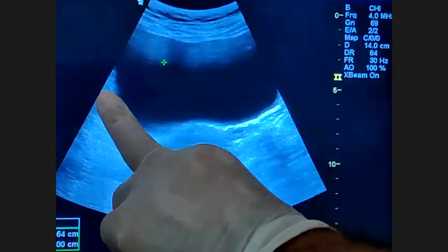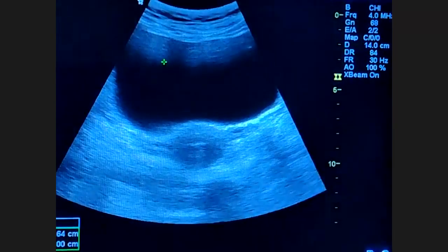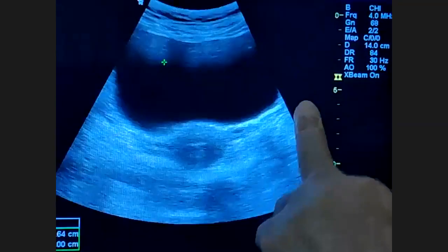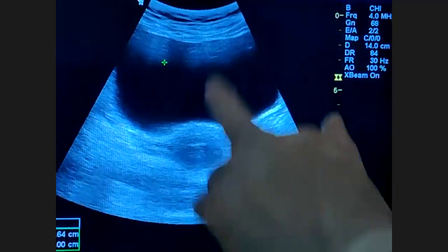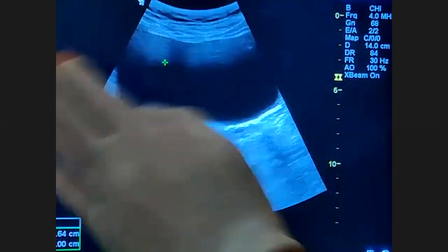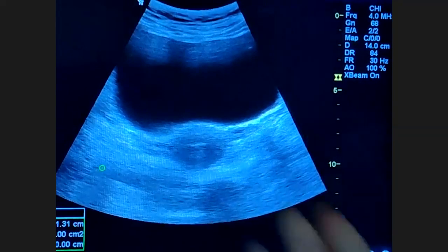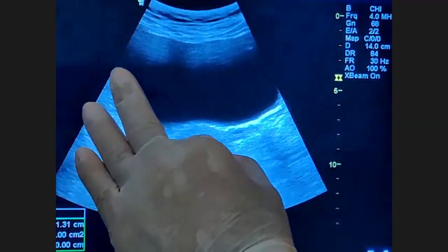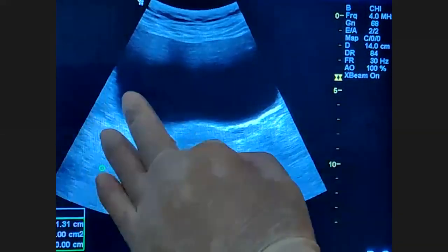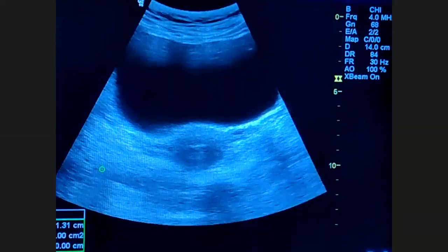What side is this? If I am in longitudinal section, is this right? Is this left? I told you that this is right and this is left for transverse section. But for longitudinal section, what side is this and what side is this? Superior and inferior. It means that my right will be changed from right to superior when I am switching from transverse to longitudinal section. Is this a bit clear to you?